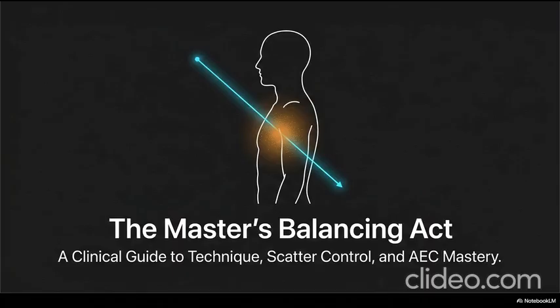Right, the mAs and the kVp. Exactly. mAs, which stands for milliampere seconds, and kVp, or kilovoltage peak. These two factors dictate the entire nature of the X-ray beam before it even exits the glass housing to touch the patient. Let's pull those apart. Starting with mAs, this is essentially the quantity dial, right? Yes, exactly. Quantity. It dictates how many X-ray photons are created.